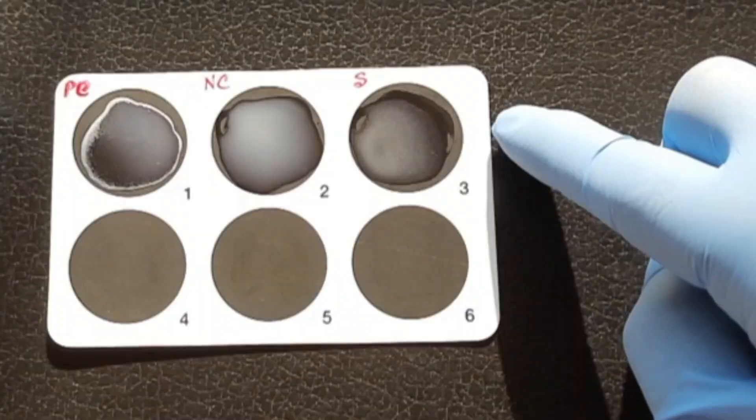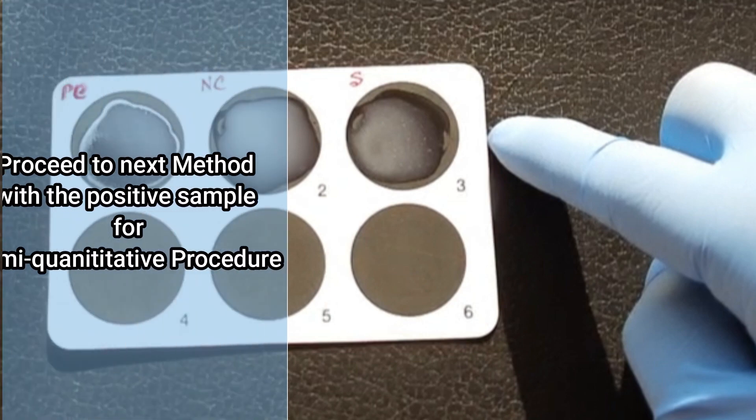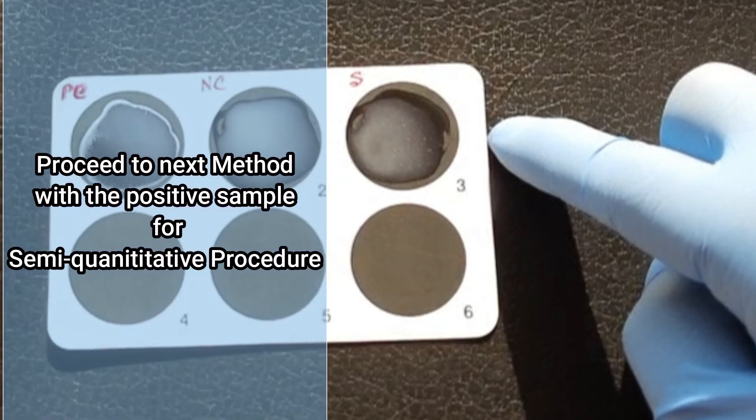If the serum contains detectable level of CRP, it will be interpreted as positive. Then the next thing to do is you have to proceed for semi-quantitative procedure to measure the CRP level, which we will show in the upcoming video.